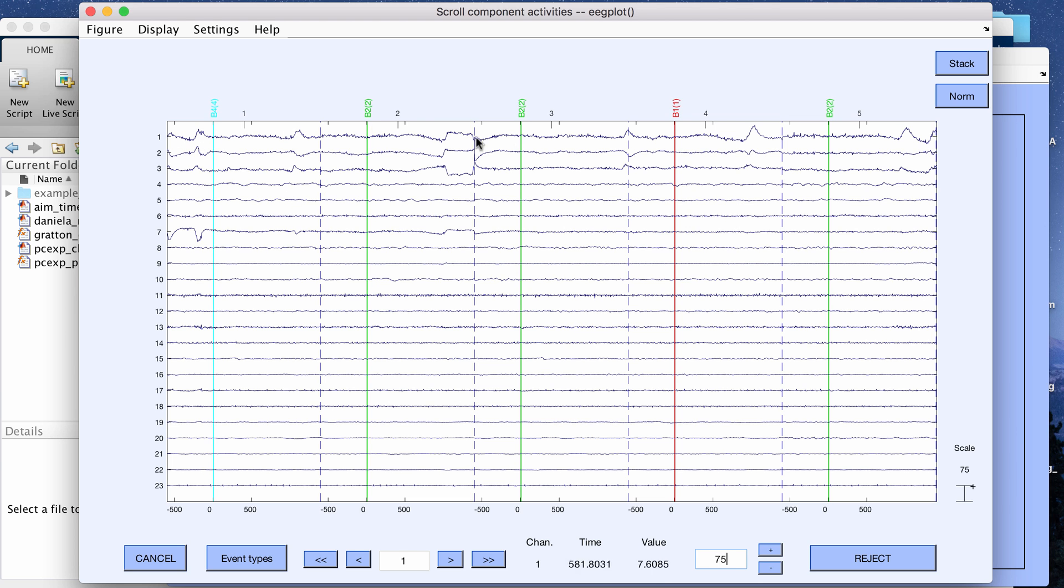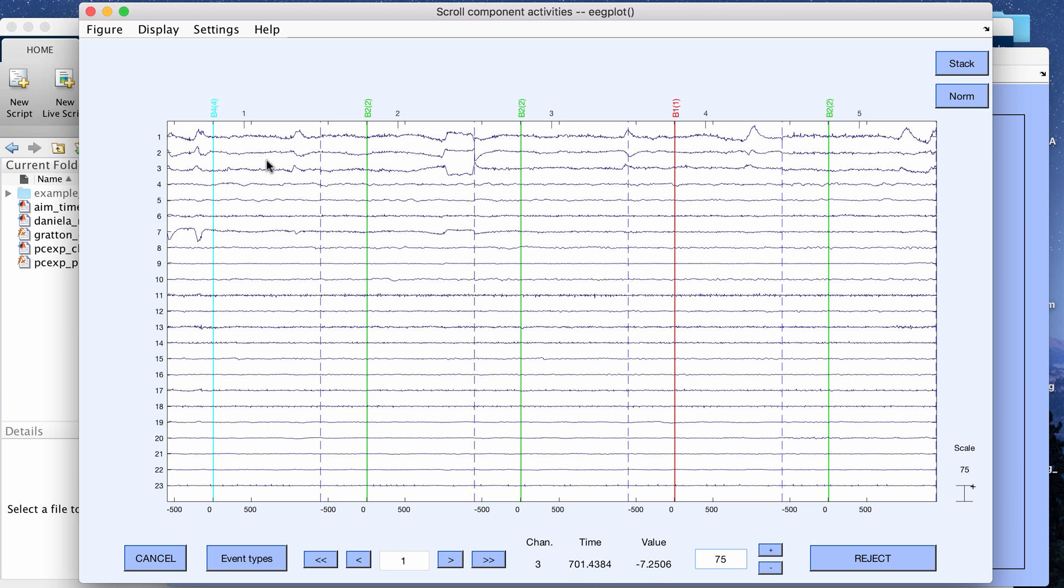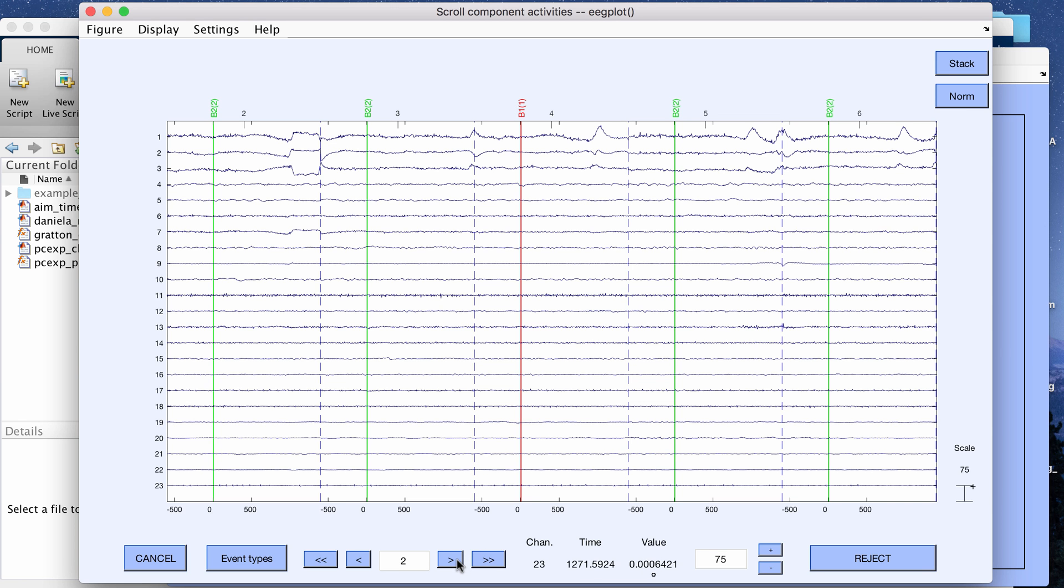As you can see the first three components seem to be picking up mostly the vertical and horizontal eye movements including the blinks. This is one way of looking at which components you want to remove from your data and you can scroll through this.